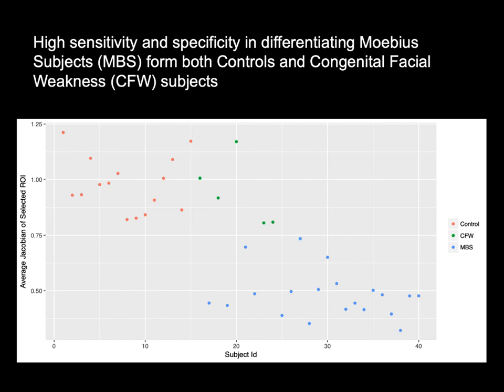We always recommend building a population template from data acquired with the same image modality, rather than going into, for instance, an ENIGMA template or a very smooth template. We have noticed a lot of mistakes. If you use the wrong template, which is not consistent with the data you have, you really lose a lot, and you have a lot of uncertainty in the registration.